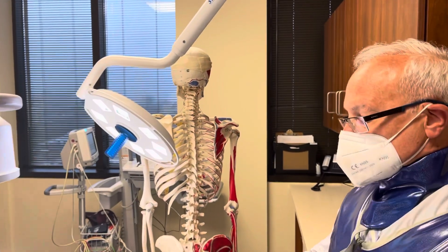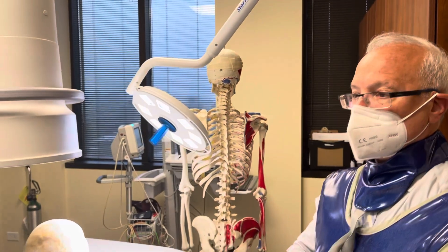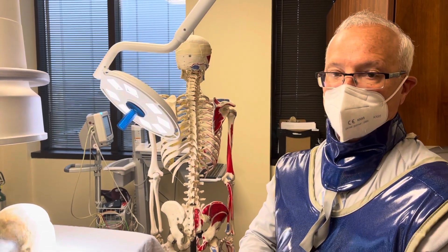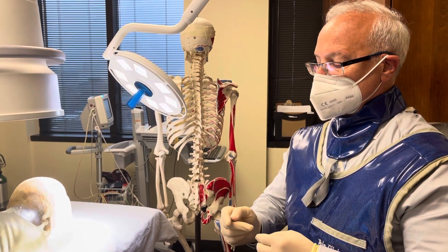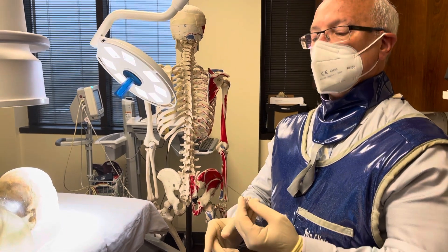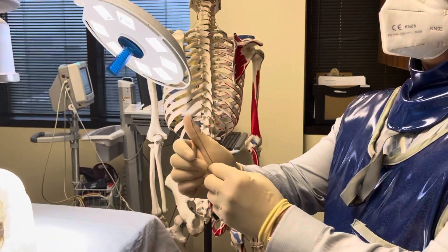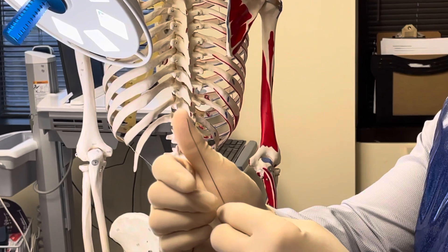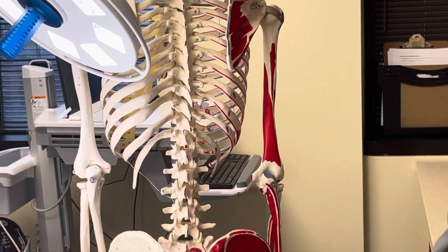I use a 22-gauge, three-and-a-half-inch Quincke-type cutting bevel needle for almost all of these techniques. I typically place a curve at the distal tip, about a centimeter from the tip of the needle, when I perform these procedures for easier steering.